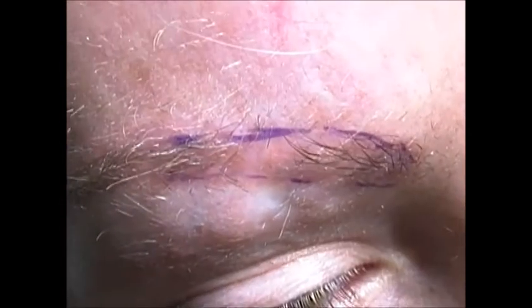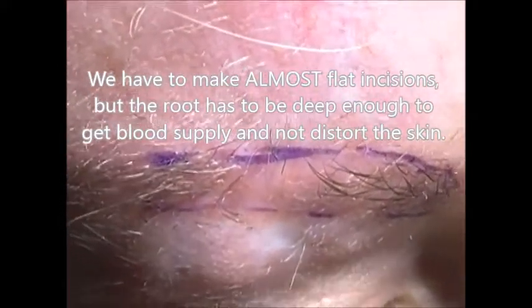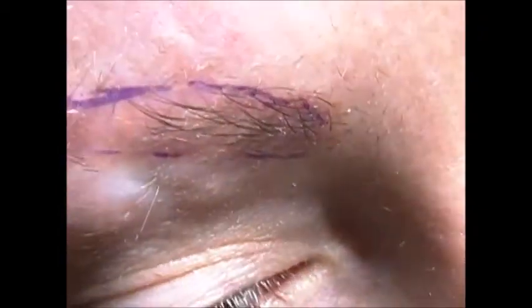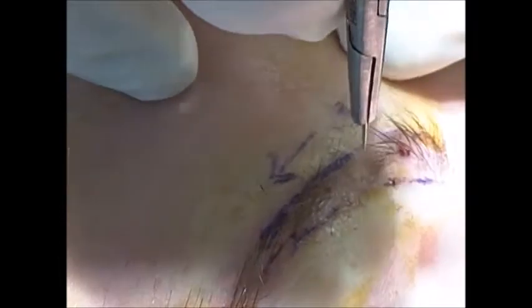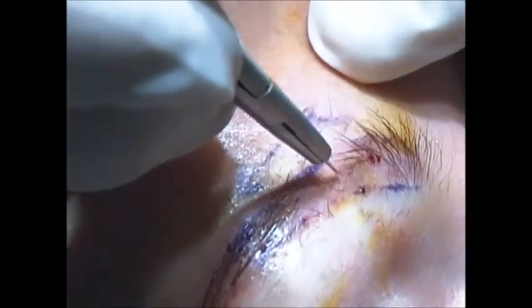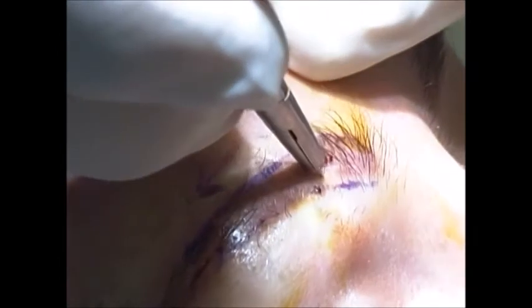Okay, so I drew the contour of your eyebrow, and you can see exactly where that scar is. And remember how we talked about how flat the eyebrow hairs need to lie with respect to your skin. Unlike the hair on your scalp, which I was trying to show, which sticks out of your head at 45 or 50 degrees. This has got to be really flat, and so I'll make the holes in a second. The ones closest to your nose kind of aim towards your right temple, and as you get over to the side, they're actually aiming kind of down. So there's a change in vector right above your eye. The key we talked about before is, with a regular hair transplant, it's an angle like this, but these have got to lay just really flat. But you have to get it deep enough that the root is underneath the skin.